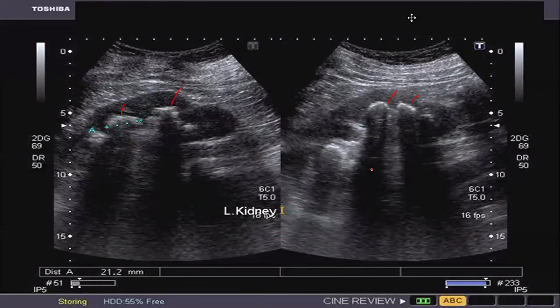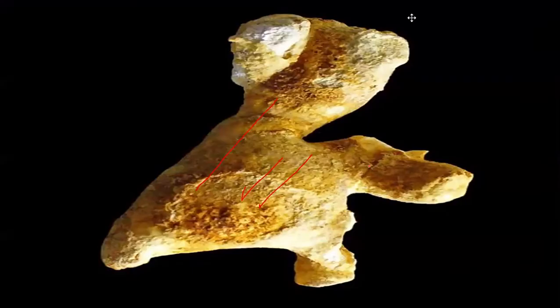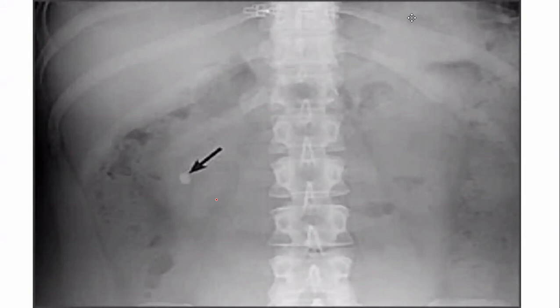Okay. Posterior acoustic shadowing. So, doctor, my challenge for you: try to Google search what you read for yourself, then maybe we will discuss it tomorrow for our class. What is the difference between posterior acoustic shadowing and posterior acoustic enhancement? Actually, they're different. The shadow of posterior acoustic enhancement is like white.